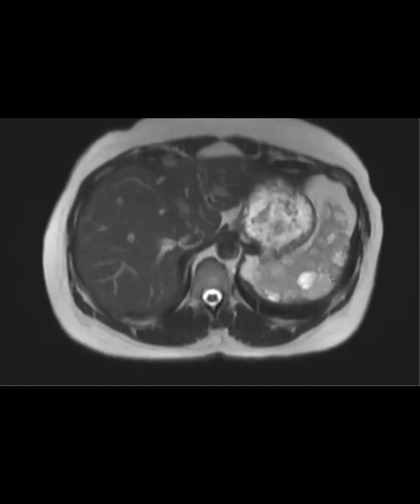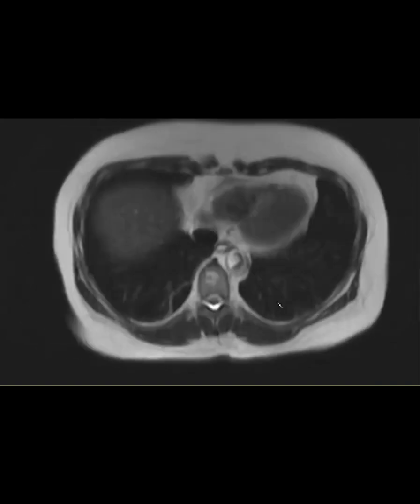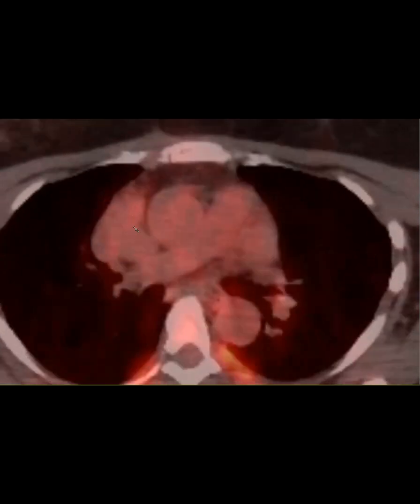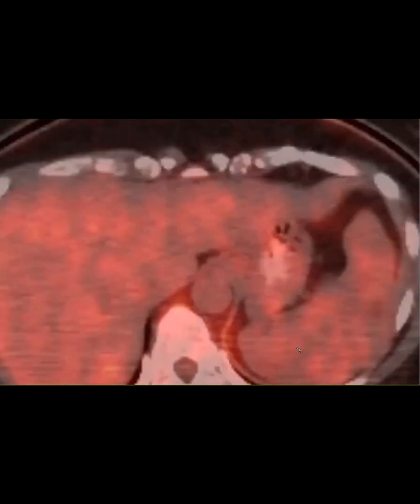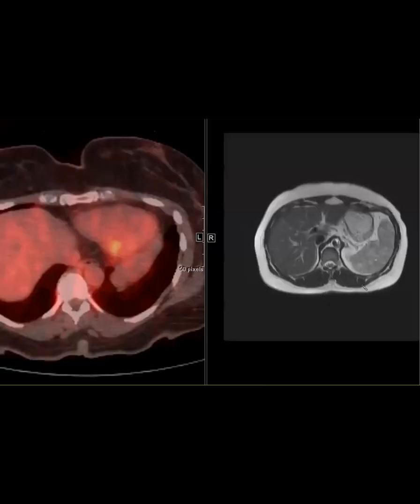It's much more common in children. And when you get it in the spleen, it's usually systemic, so it's affecting multiple organs. This patient also had a mediastinal mass. None of these things were very FDG avid, and so it would have been quite atypical for lymphoma. I don't know why this is looking so weird, but anyway, this patient ended up having histiocytosis X or Langerhans cell histiocytosis. So for example, you can see there's a mediastinal component that wasn't very avid. The spleen was not very avid, so that would be very unusual for lymphoma, etc. So I just thought this was cool. Interesting finding.